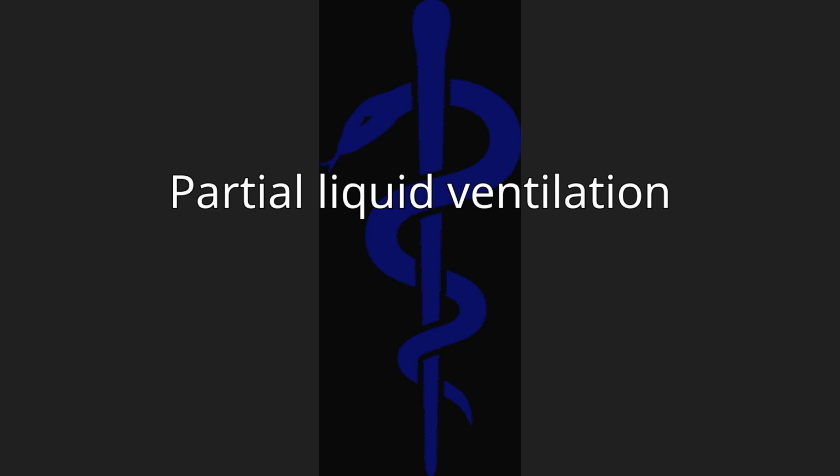Partial liquid ventilation. In partial liquid ventilation (PLV), the lungs are slowly filled with a volume of PFC equivalent or close to the FRC during gas ventilation. The PFC within the lungs is oxygenated and carbon dioxide is removed by means of gas breaths cycling in the lungs by a conventional gas ventilator.